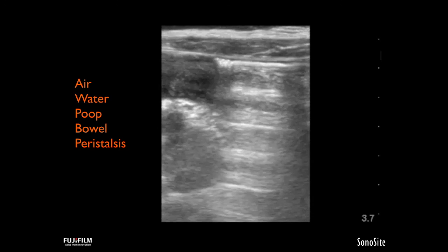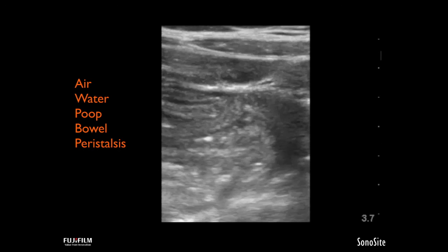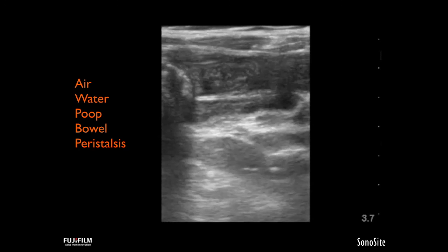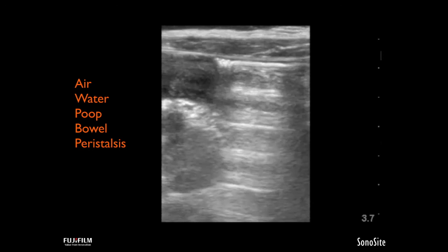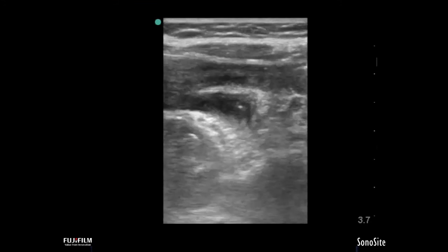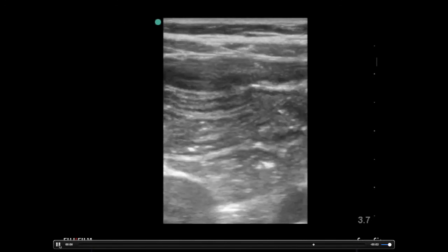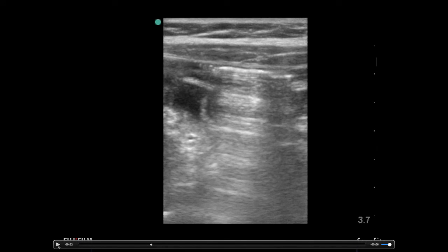As you march your way up, give some graded compression — a little squeeze down toward the patient's back. That eliminates some of the overlying soft tissue and any bowel air to give us good visualization of the bowel wall and peristalsis. Let's bring it to real speed. Air is going to appear as those hyperechoic lines we're used to seeing when evaluating the chest for pneumothorax. You can identify these hyperechoic lines as the air pattern.